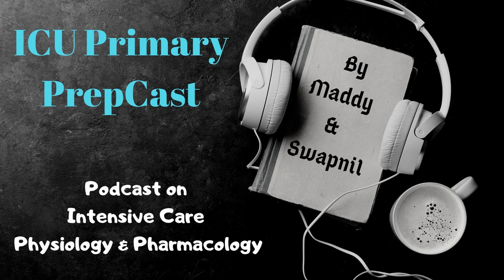Thanks, Maddie. It's also important to understand that this technique needs recalibration quite frequently. So every 6 to 12 hours, you need to recalibrate the whole monitor. And the algorithm fed into these monitors is based on healthy volunteer cardiac output measurements. So in extreme cases, where people are in extreme shock or have arrhythmias, this is obviously not going to be accurate. So again, be mindful of the limitations of this technique and don't use these monitors on every single patient in ICU for cardiac output monitoring. You have to choose the monitoring device which is more appropriate for your patient.